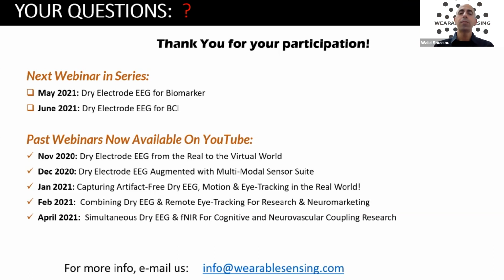So we don't have enough channels to do source localization with this device. We are reaching out to some groups that are developing some interesting software. For example, the group at USC is developing Brainstorm, and we're hoping to work with them to see how we can use their analysis software, which is a very nice software platform that brings in multimodal data from MRI, fMRI, fNIR, MEG, PET, all sorts of data.